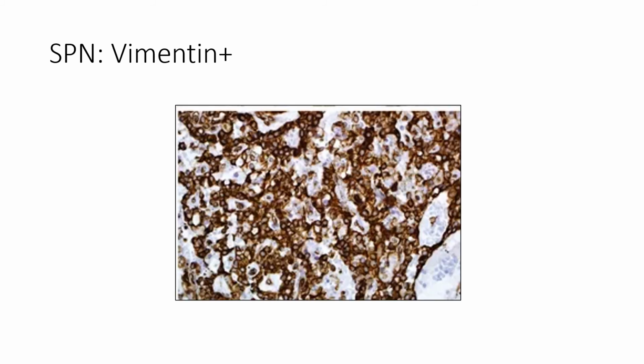SPN is also positive for CD10. Here you can see these tiny dots of brown staining surrounding the malignant glands. So it is CD10 positive, and it is strongly positive for vimentin.